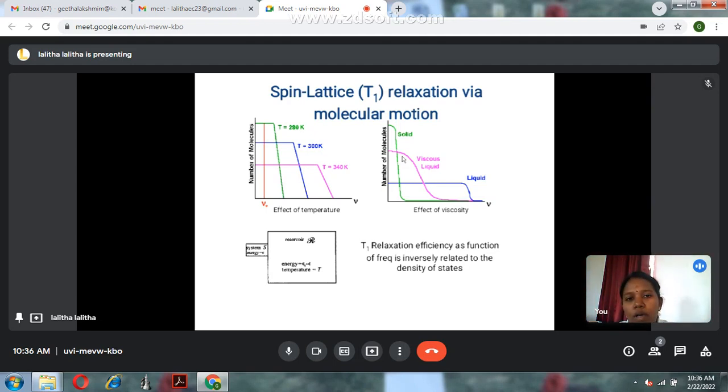So this is the MRI. MRI can be used to produce images of our human body. It also has an advantage over CT scan and X-ray scan, because it produces images of the internal organs of our body with good image quality.